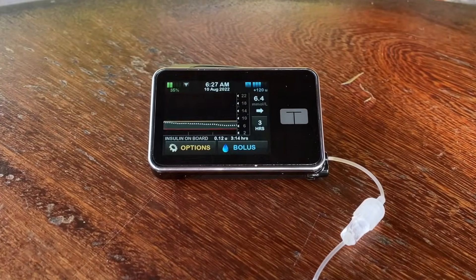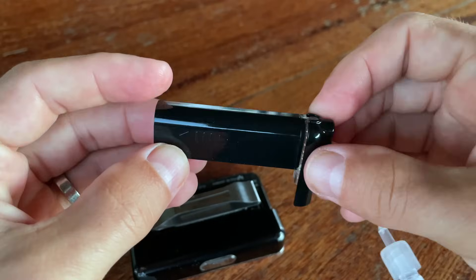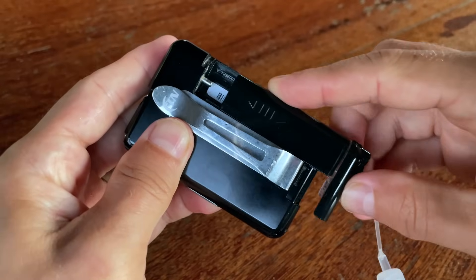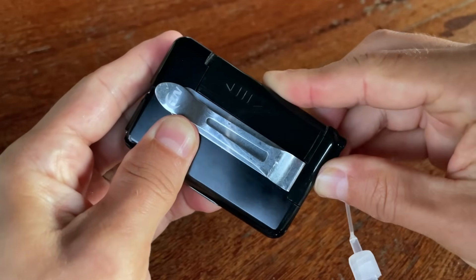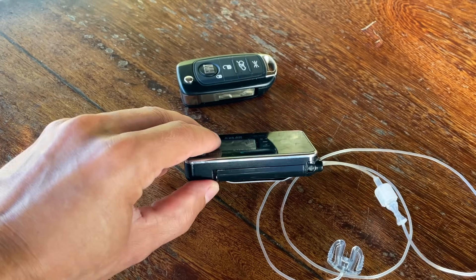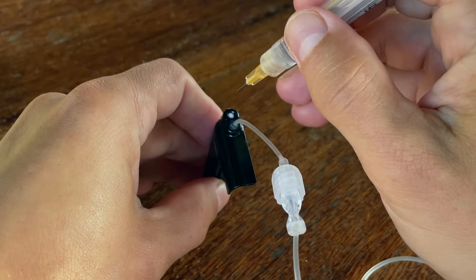An interesting thing about this pump is that the insulin is not stored in a plastic cartridge but in a bladder system which has a 300 unit capacity. A big advantage of this is that Tandem was able to save a lot of space by not using a plastic cartridge, making the pump sleeker.